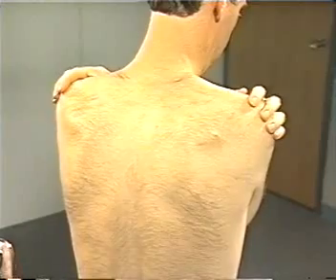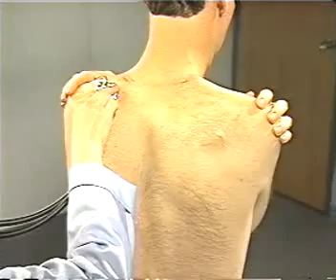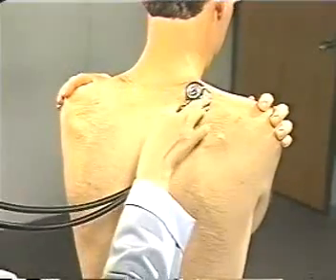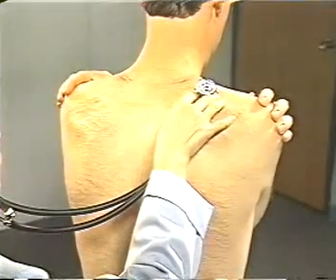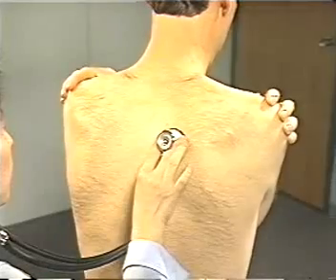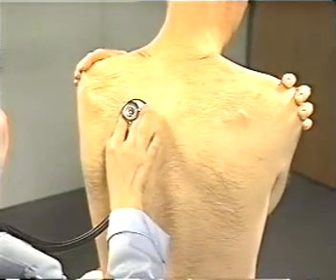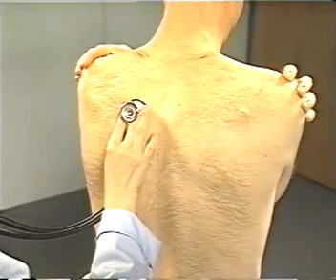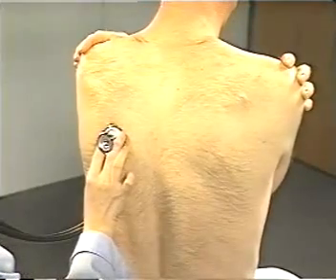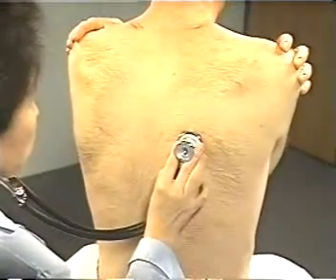Now let's listen as the examiner auscultates.